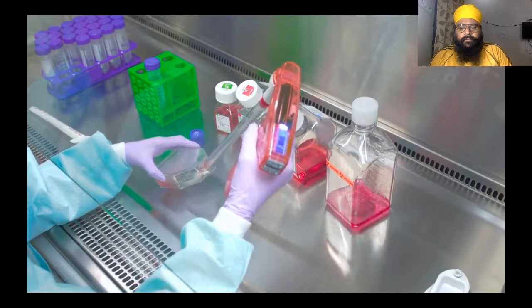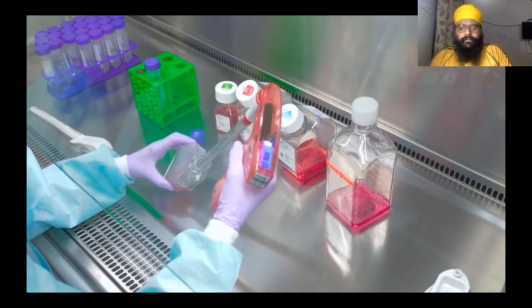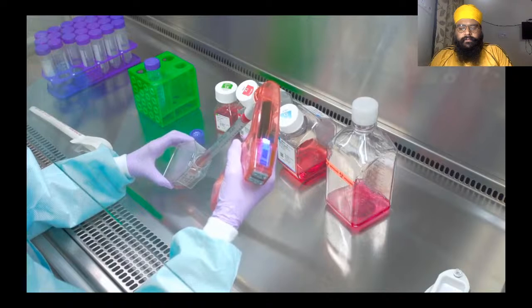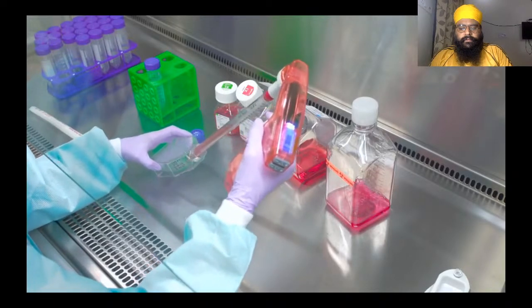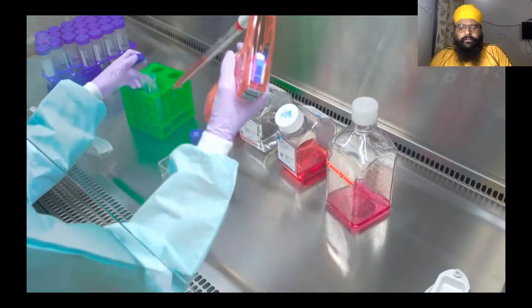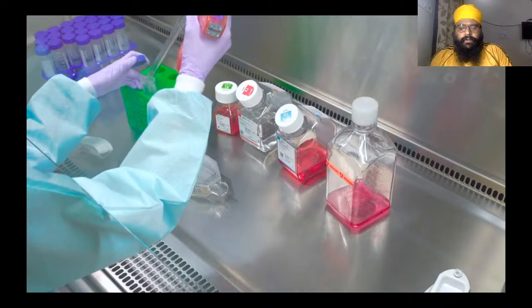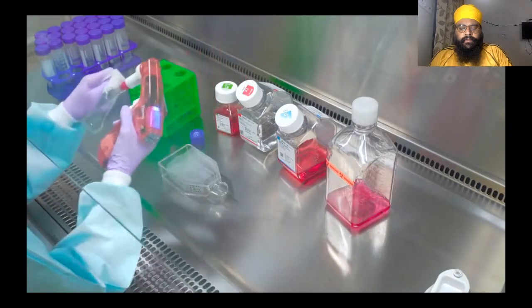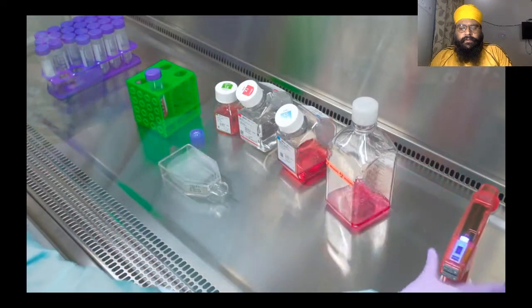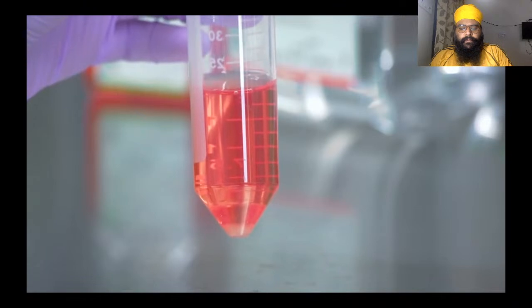If you are using trypsin, the collection medium will need serum, or you'll need to use a trypsin inhibitor to inactivate the trypsin. If you're using TrypLE, inactivation is achieved by dilution alone. No serum is needed. Transfer the cells to a conical tube and centrifuge to remove any residual dissociation reagent. The speed and time of centrifugation will vary based on your cell type. After centrifugation, you should have a well-formed pellet.